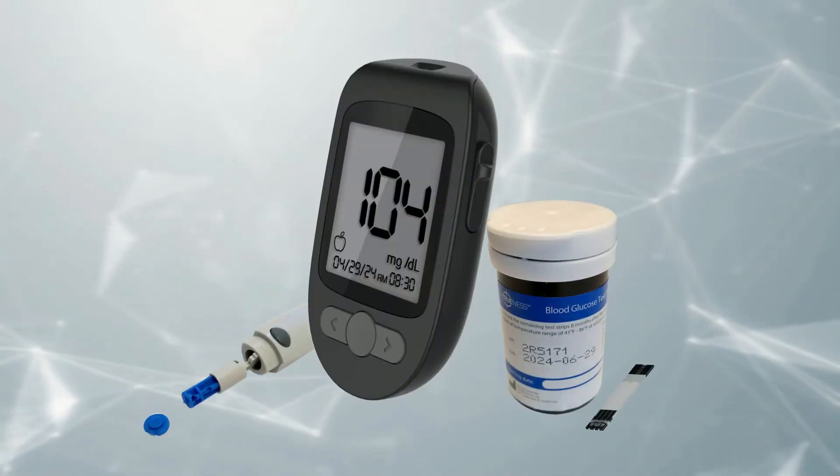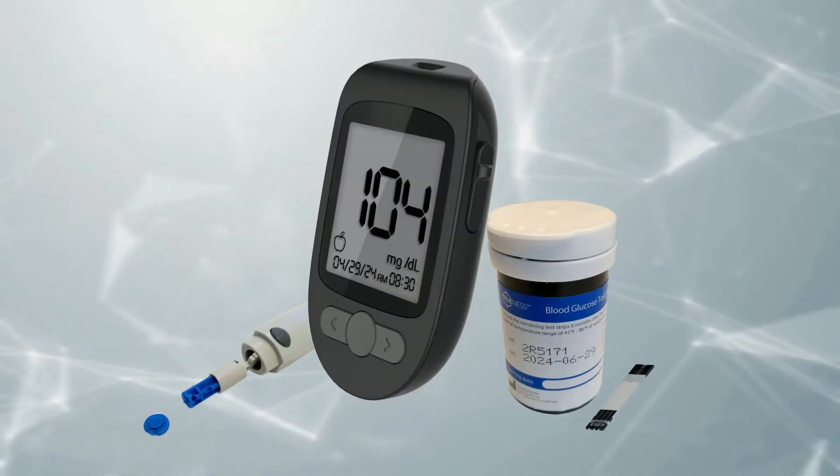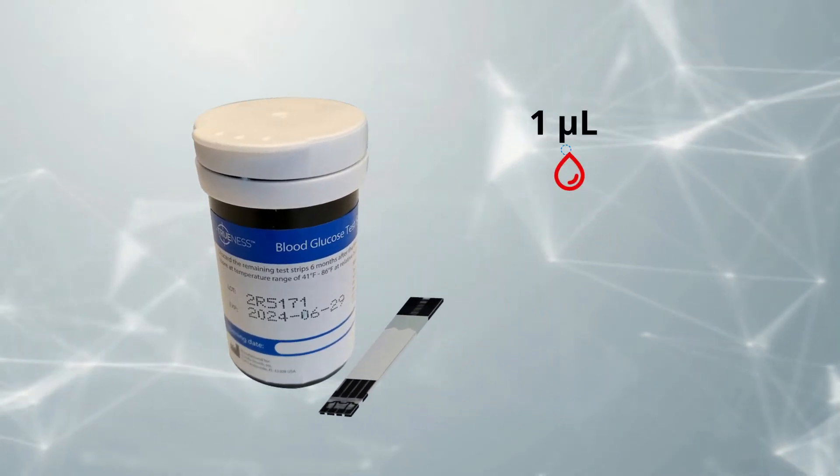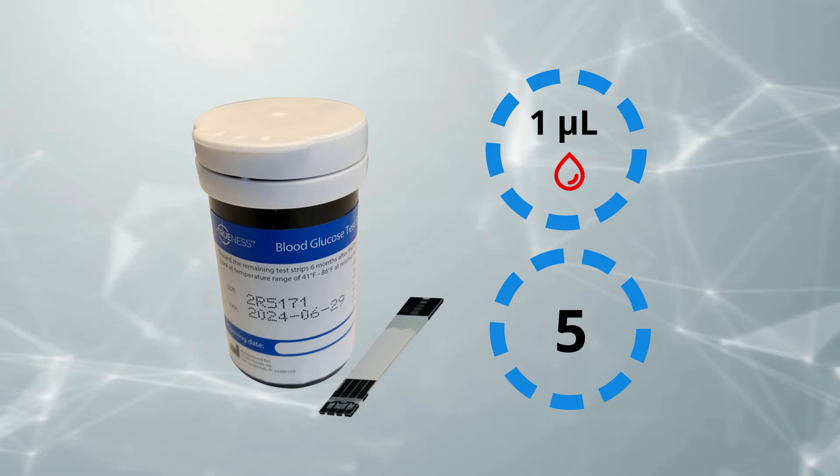Let's start by showing you how easy it is to perform a blood glucose test. The Trueness Test Strip only requires 1 microliter of blood and provides results in 5 seconds.